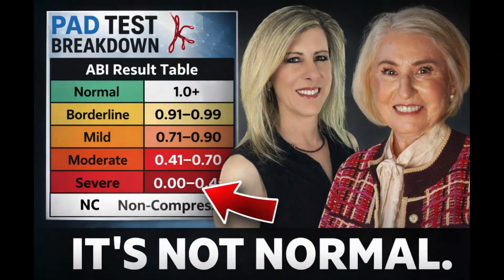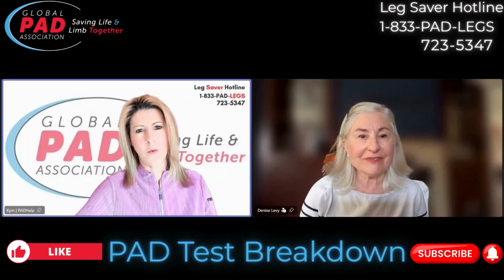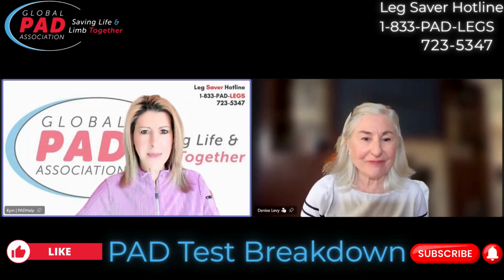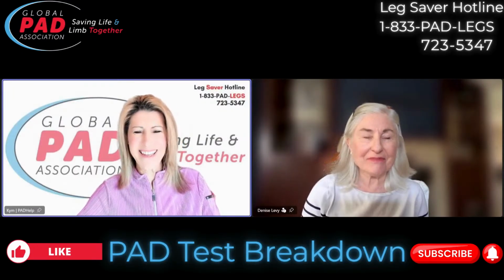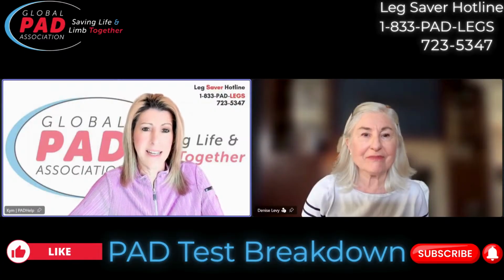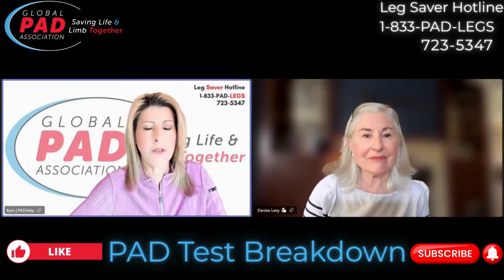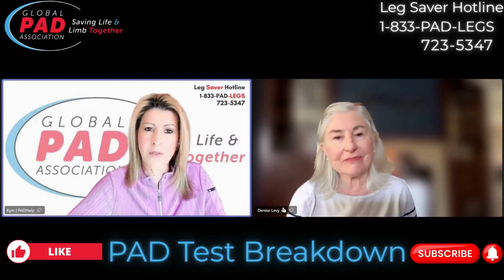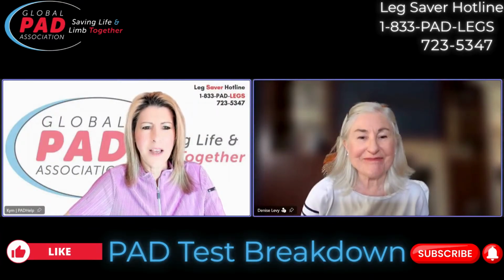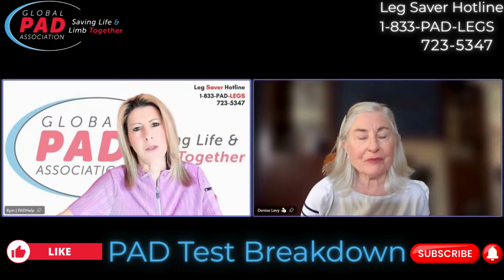Hey everyone, welcome to another PAD test breakdown. We have Sharon with us today, and of course, our amazing world-renowned RVT Denise Levy, who is going to walk us in the door to a consult with Sharon, how she normally talks to patients before she performs any PAD testing, so we can learn a little bit more. And we're not here to diagnose. We don't diagnose. We're just here to help patients understand their results so they can ask better questions. We even help with questions, don't we, Denise? Yes. So why don't we walk in the door and get the backstory from Sharon before we start looking at her results?